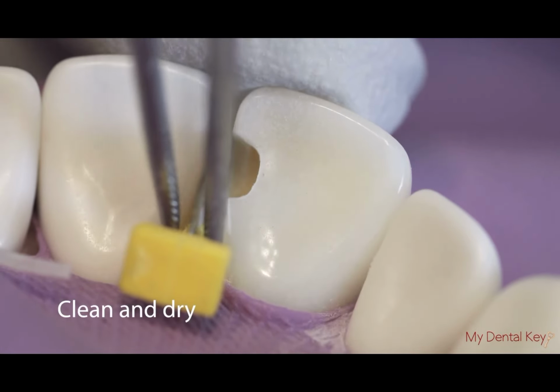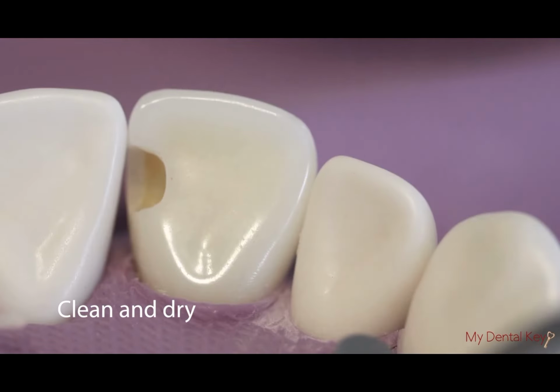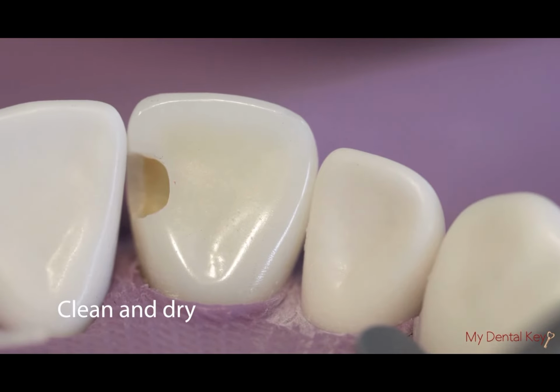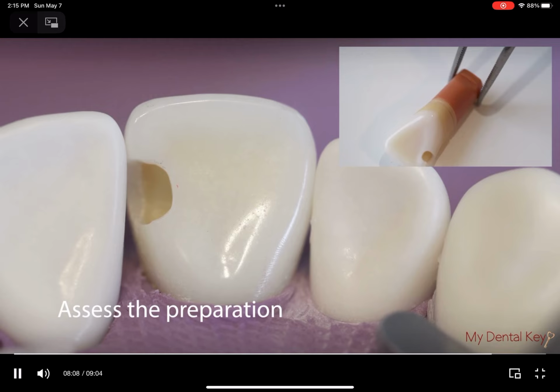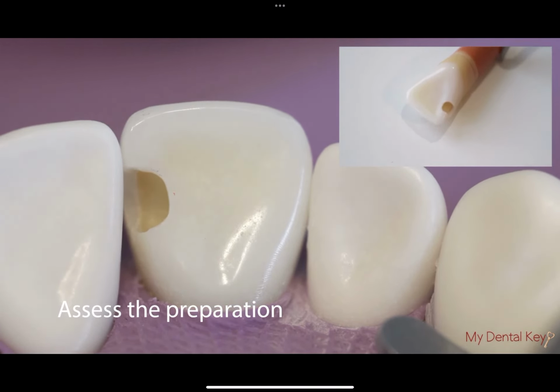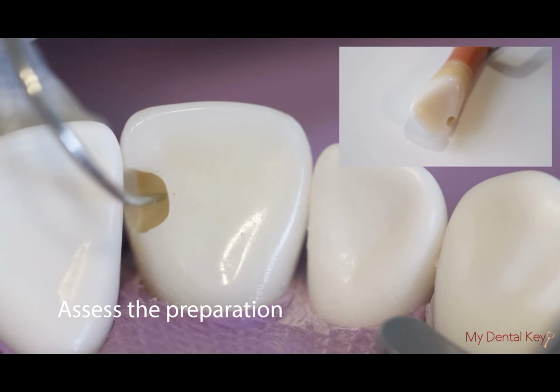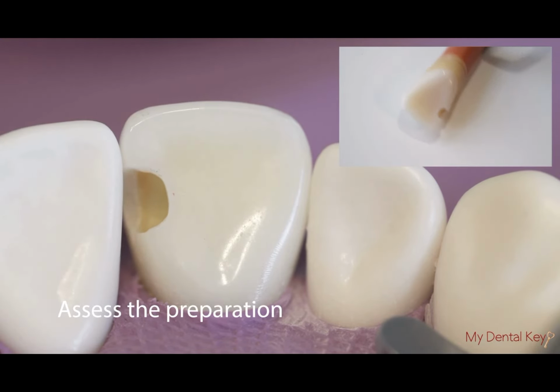Once the preparation is smooth, all caries are removed and you are finished with the preparation, clean and dry using the air-water syringe. Examine and self-evaluate your preparation. Use the Explorer to check for smoothness and any remaining caries, and use the probe to check for proper dimensions. Refer to the candidate manual or our checklist to guide your self-evaluation.